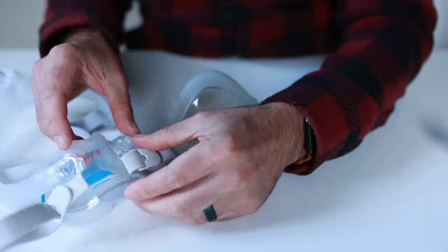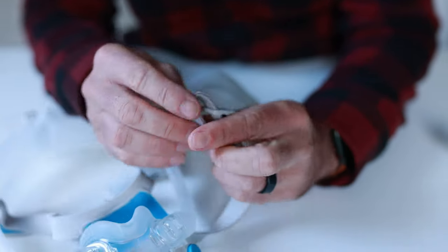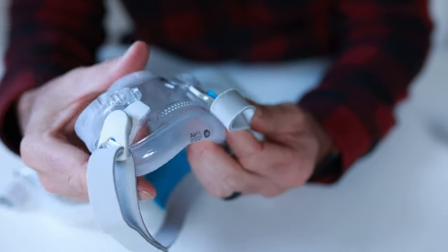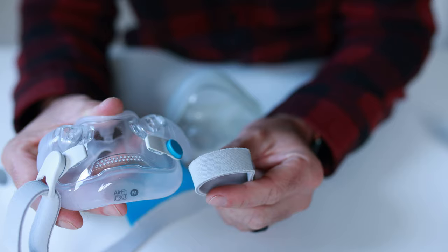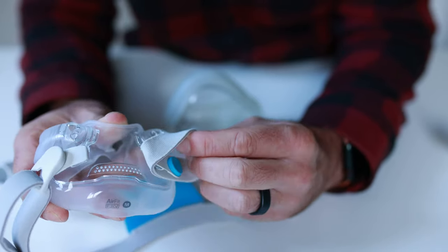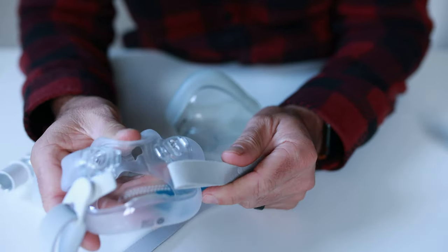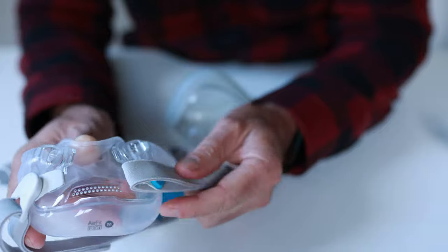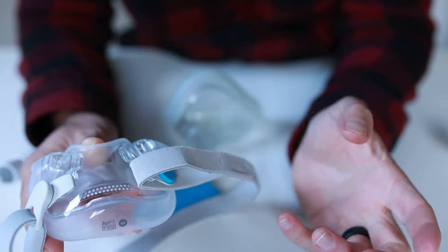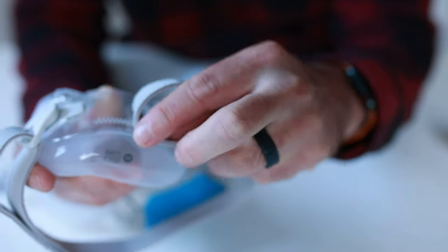Now with the F30i here, what you can do if your clip breaks — let's say you don't have a clip anymore. If you don't have a cable tie, with the F30i you can just thread it up underneath the clip and that will also get you by for a night. It's not totally secure — I prefer having cable ties — but if you don't have cable ties, just thread it up underneath the clip.